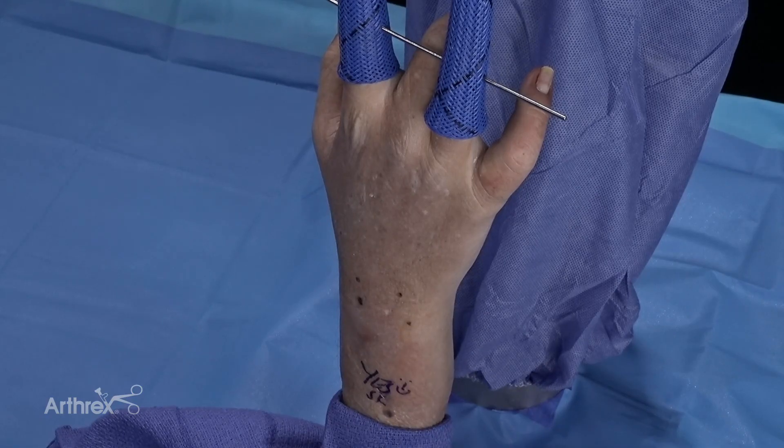Today we're performing a wrist arthroscopy, but nanoscope technology can be used not just for intra-articular pathology — for example the wrist, the thumb CMC or MP joints, or the finger joints — but also for extra-articular pathology such as carpal tunnel, cubital tunnel, de Quervain's tenosynovitis, or trigger finger.